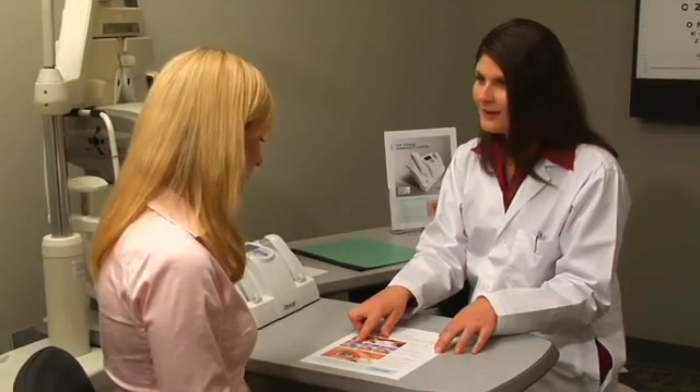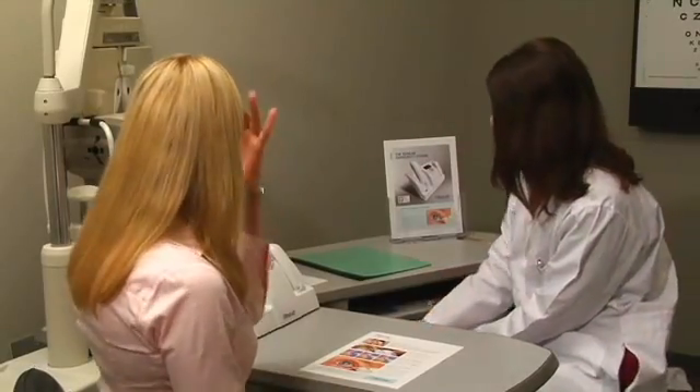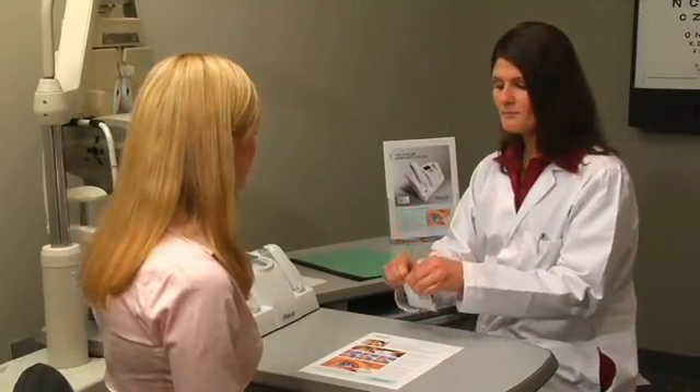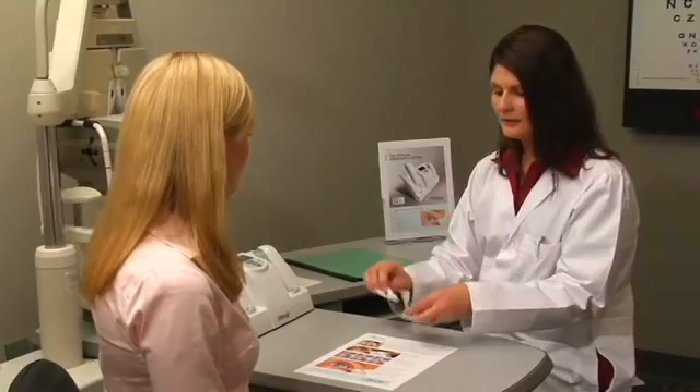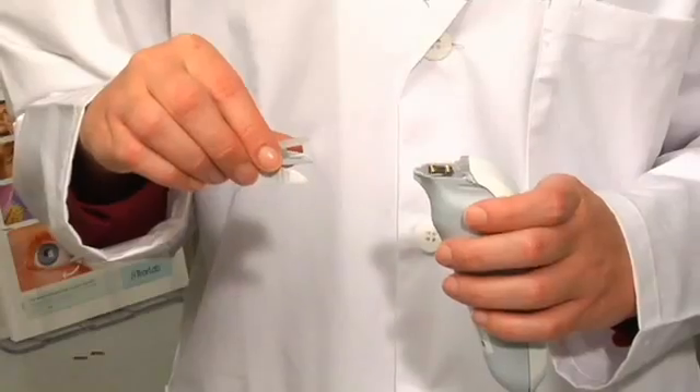After explaining the procedure to the patient, you are now ready for patient testing. Remove a test card from the pouch and note the numeric code on top of the card. Remove a pen from the TearLab. Hold the wings of the test card and insert the test card onto the pen.